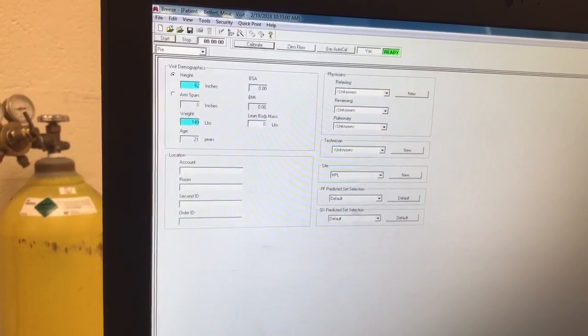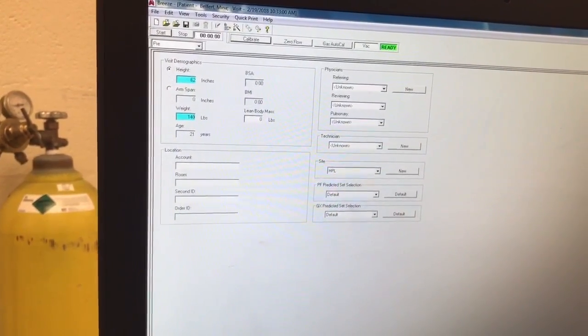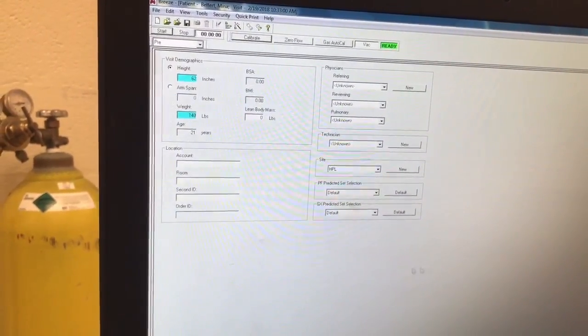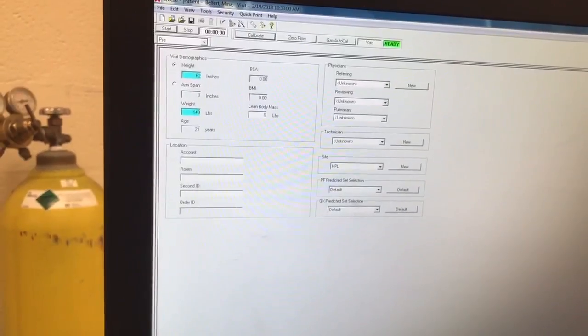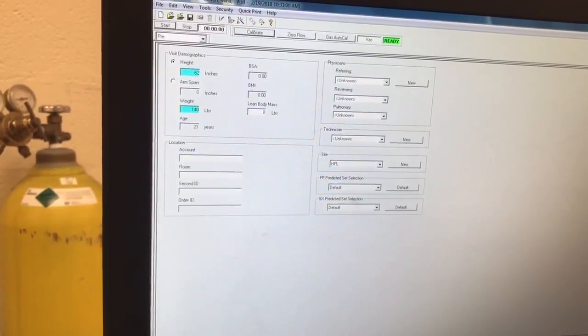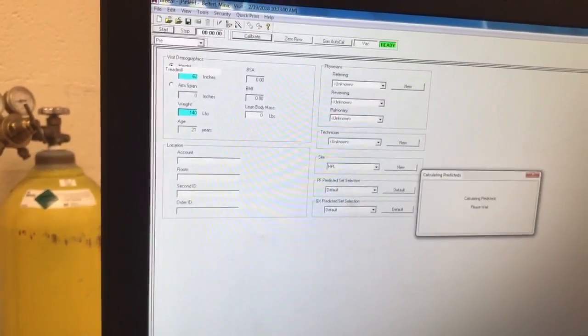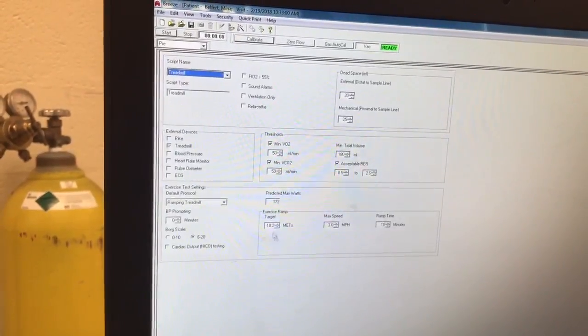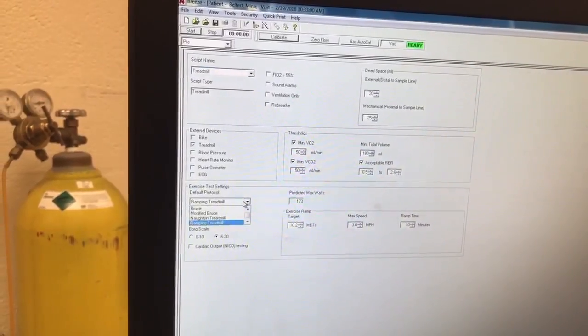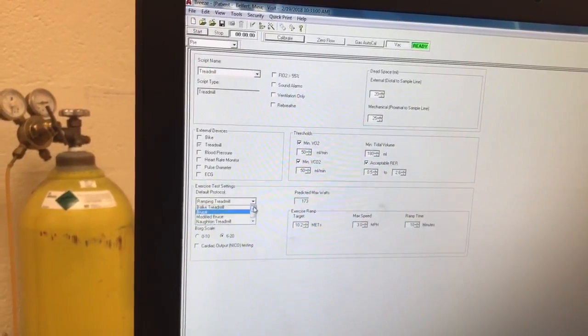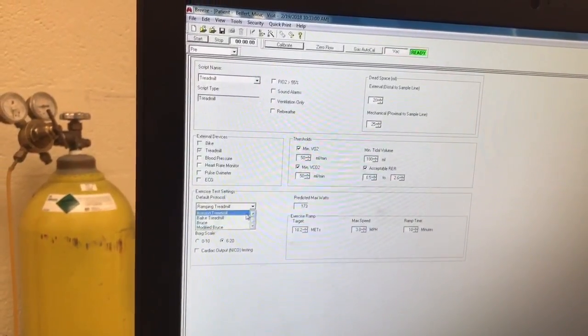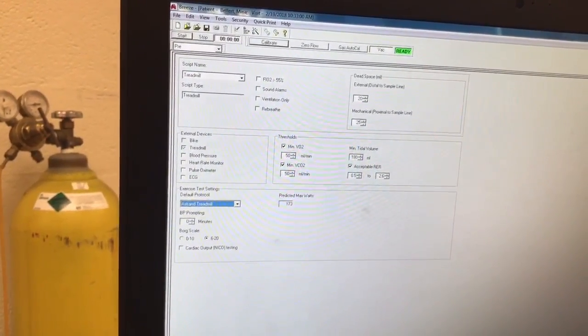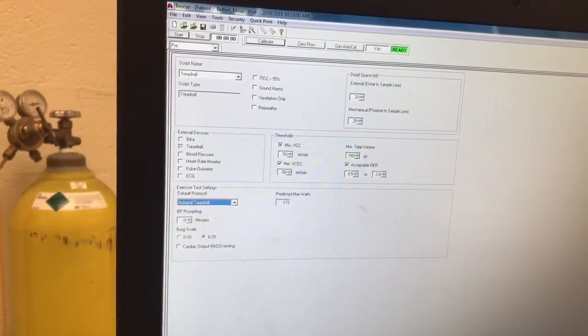Then click graded exercise test, abbreviated GXT, in the bottom tabs. Select the appropriate protocol. Congrats, you are now ready to run a VO2 max test.